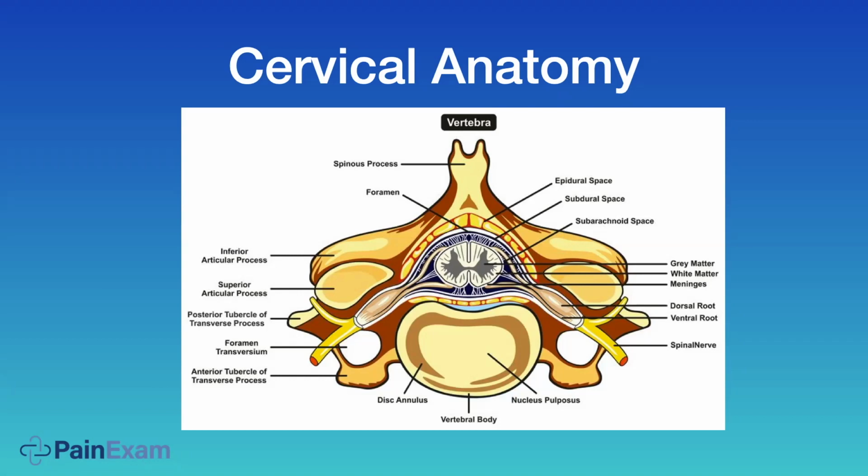It's great that you can ultrasound from any side and see vital structures because of the size of the neck. The width of the neck is so narrow compared to the torso, abdomen, pelvis. You can get on all sides, and you can do shots from the side much easier, and therefore you can see the nerves as they leave.